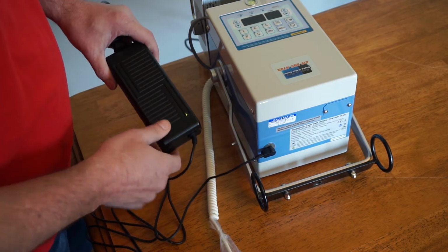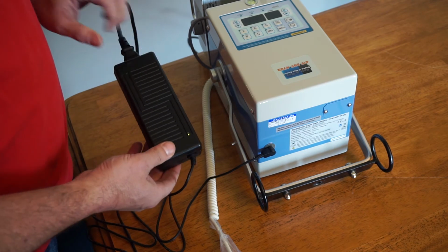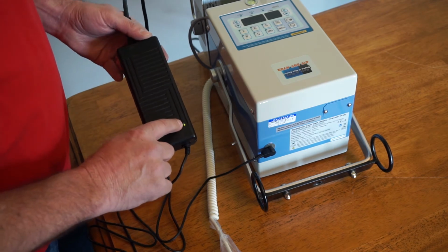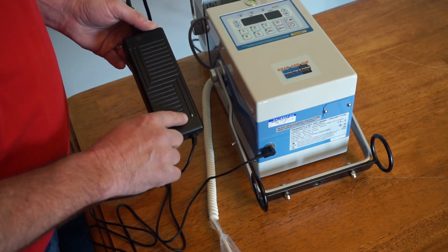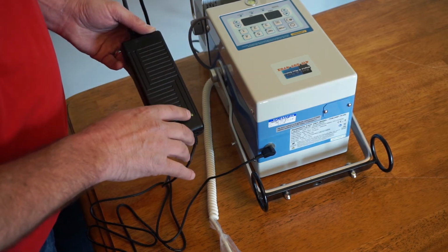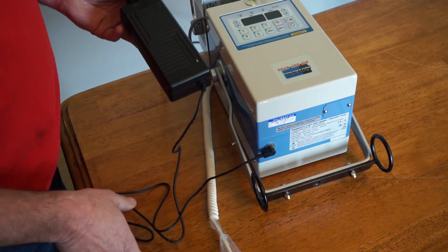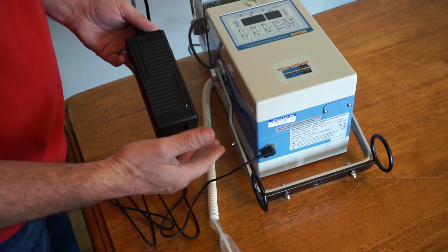When you plug it in, if this percentage of the battery life is below 70%, this will be amber in color. Right now it's in the 90s, so it's green. Say if it was down at 40%, it would be amber, and when it does get to 70%, it turns green. And at that point you think, well, it's green and it's fully charged.